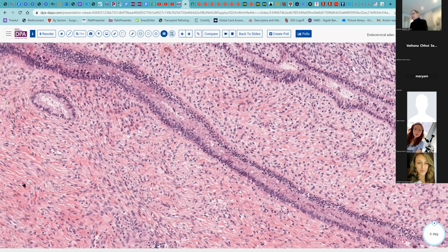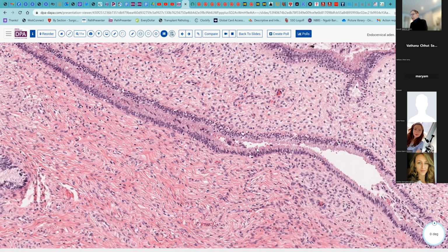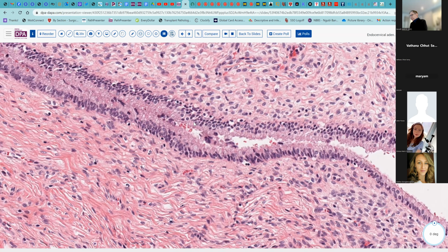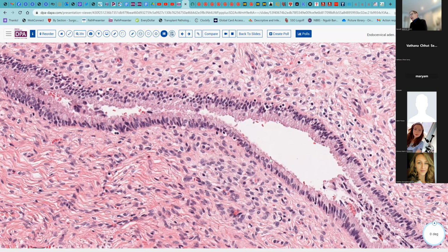But as we look at these cells, I think you would be able to identify that we have these clear PEG cells that are part of ciliated metaplasia. And as we were to go along here, we would see there are very nice terminal bars along the epithelial surface. So we have a ciliated type metaplasia here. And that can be sometimes difficult to distinguish between endocervical adenocarcinoma in situ, if it's very florid or has a little bit of atypia.